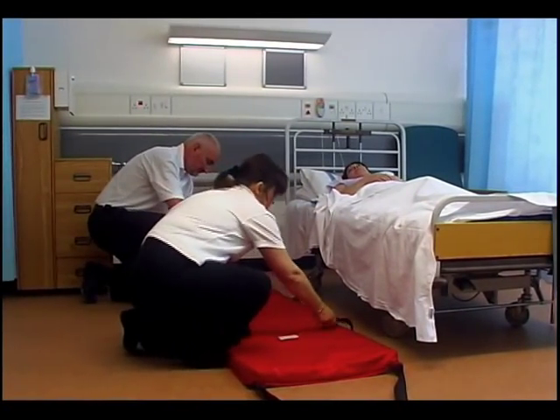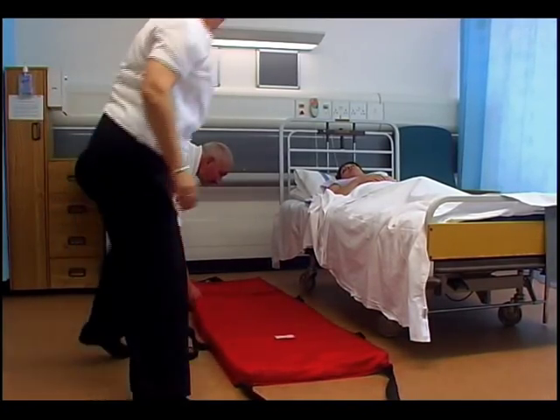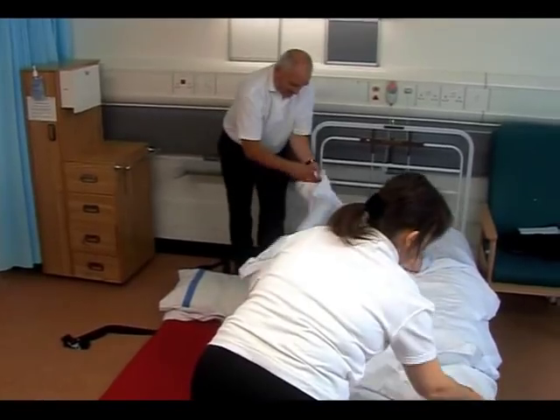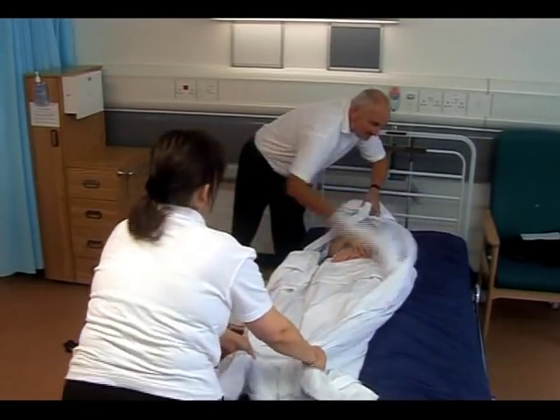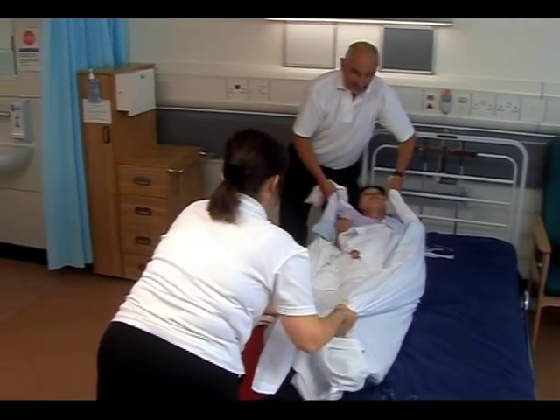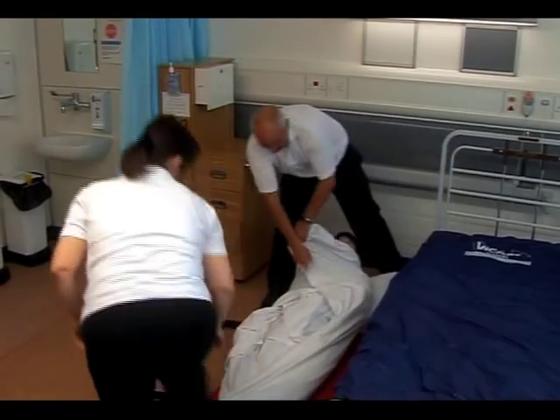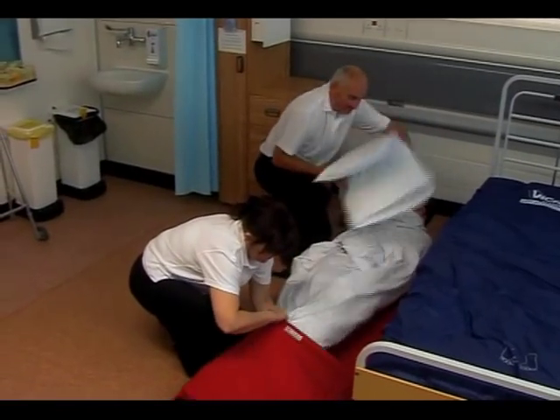In the second scenario, the ski pad is laid alongside the bed with the buckles facing the bed in preparation for the patient or resident to be transferred. Remove the pillow from under the patient and place it at the head end of the ski pad, wrap the patient or resident in the bed sheet, and move the patient to the edge of the bed by using the sheet as a sling to lower them onto the ski pad. As this technique involves a degree of lifting by the carers concerned, it is not endorsed as suitable by manual handling departments in some hospitals and care home groups.